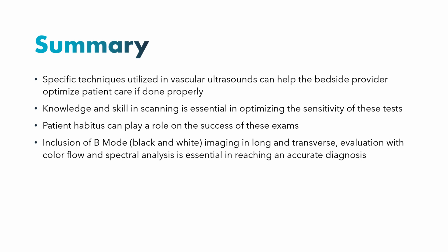So in summary, specific techniques utilized in vascular ultrasound can help you, as the bedside provider, optimize patient care. If done properly, it can save the patient radiation utilized in other sorts of imaging techniques, and it can give you your answers very quickly. It does require a lot of knowledge and skill in scanning, understanding ultrasound along with your anatomy and your physiology in order to optimize the sensitivity of these tests and come up with the accurate diagnosis.